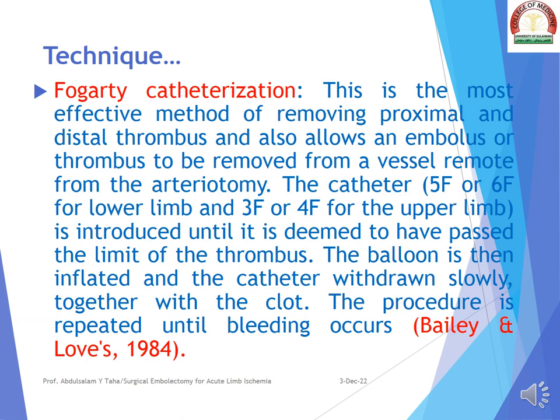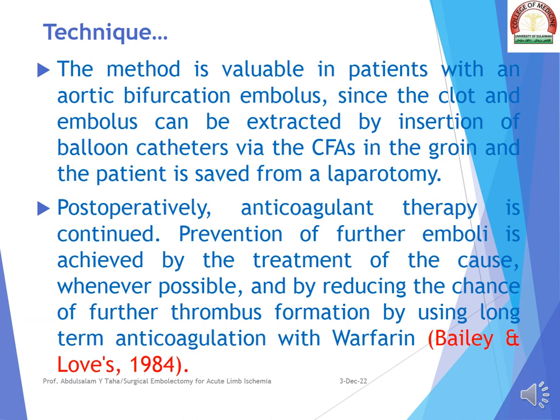The method is valuable in patients with an aortic bifurcation embolus, since the clot and embolus can be extracted by insertion of balloon catheters via the common femoral arteries in the groin, and the patient is saved from a laparotomy.